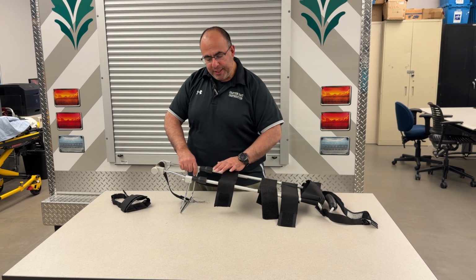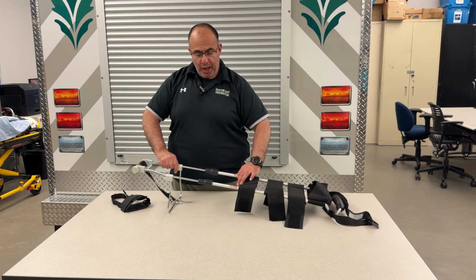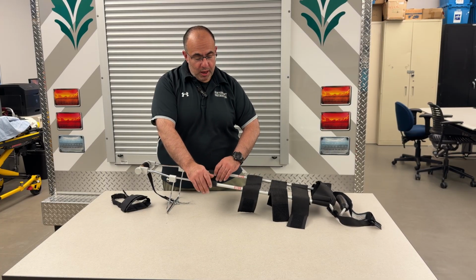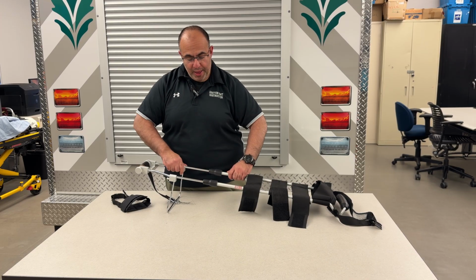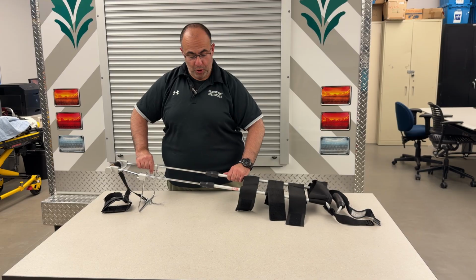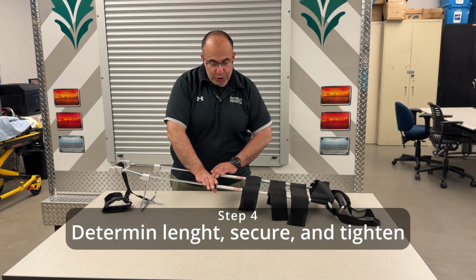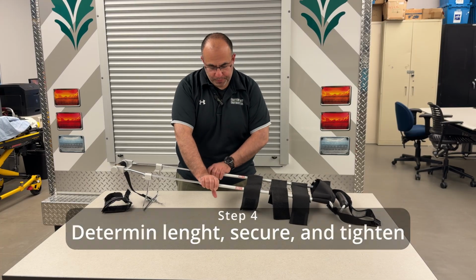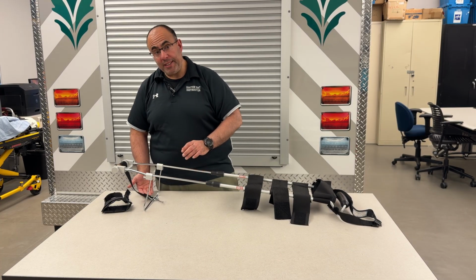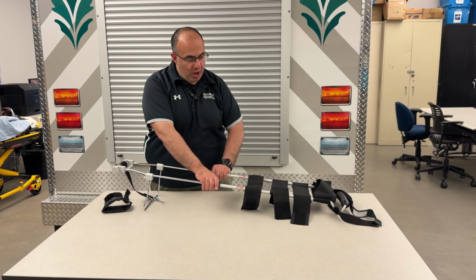As I'm measuring, this is like a telescope or a trombone, if we remember what a trombone is. You loosen up these black securing mechanism straps here. You loosen them up, and then you're able to slide this up, right? Again, like a trombone or a telescope. Once you determine the actual distance from the uninjured side, you secure it hand tight. Your kickstand is dropped down, and this mechanism right here is used to apply that mechanical traction.